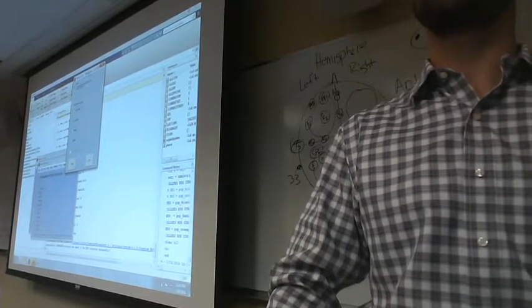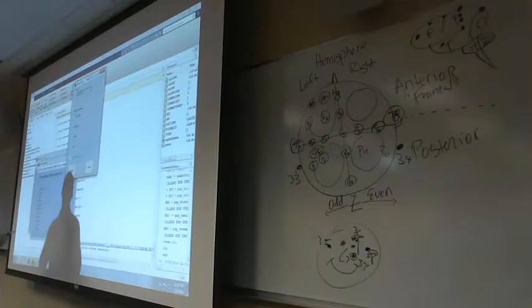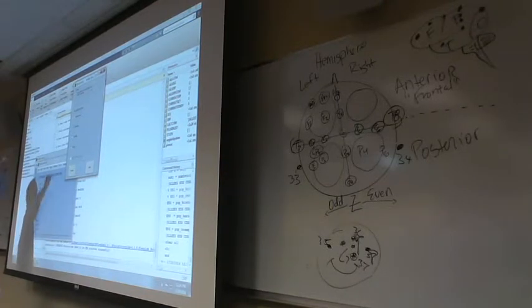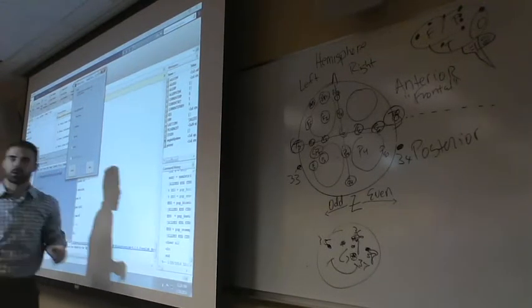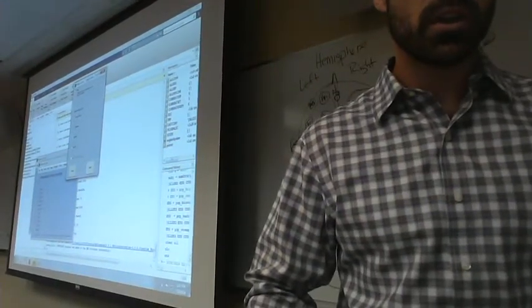Okay, so we get this little GUI that pops up. It asks us a question. What it's asking us is, how do you want to have the event code information shown in the structure of the data? We can either label it with code labels or bin labels or these things. I'm going to hit numeric codes. So just do that for numeric codes and hit apply.